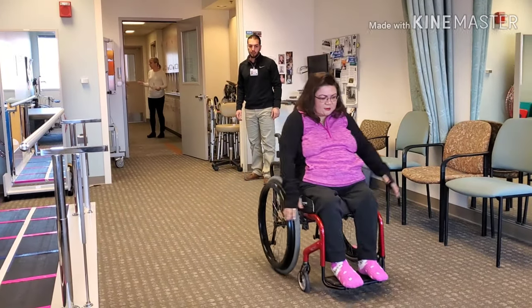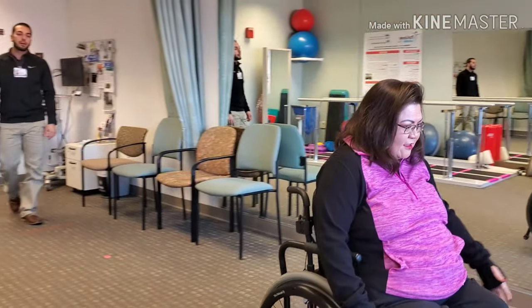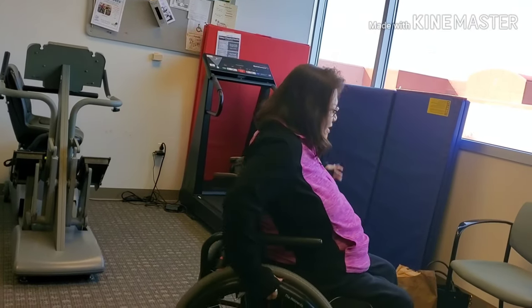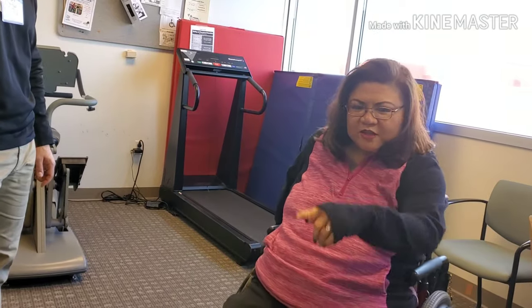I think my wheelchair needs an alignment, huh? Needs some maintenance, yeah. We'll take a look — once you get out of it, I'll roll it and see if it's pulling to the left pretty hard. It's going this way. So I'll take a look at that. But that's a much better technique — kind of push and roll, then go up.